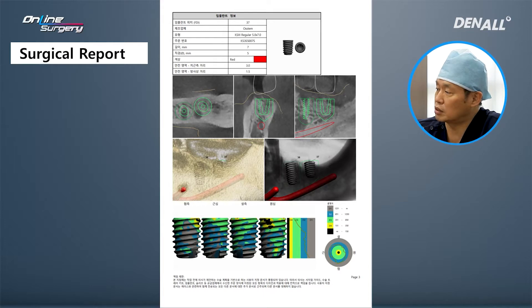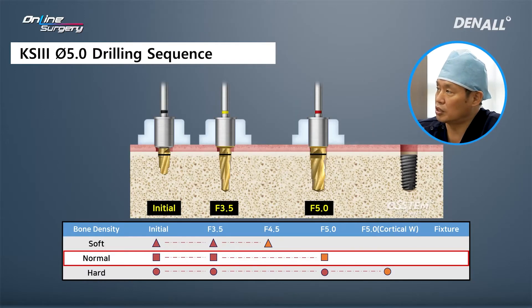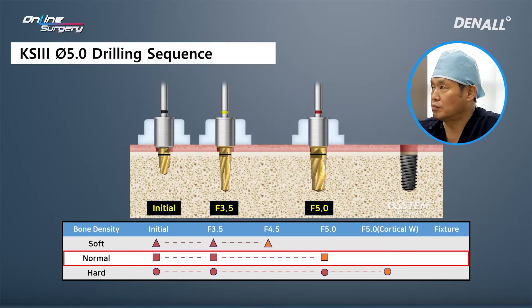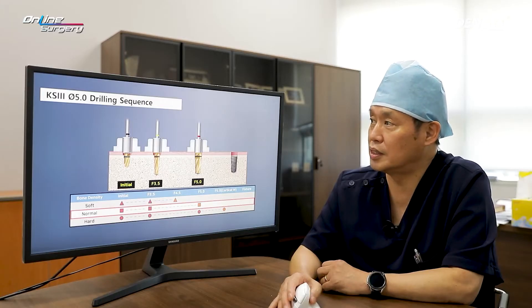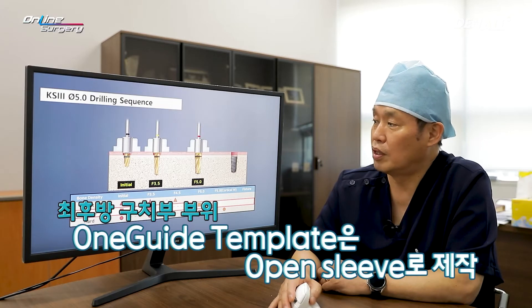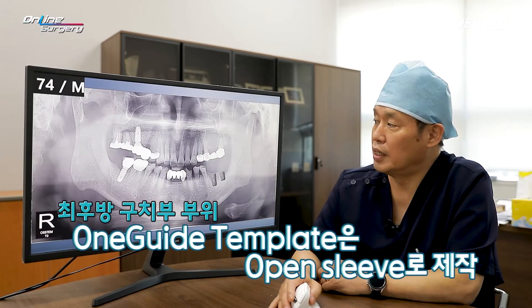This is the extraction socket — the alveolar bone state is fairly favorable. KS3 5.0 implants were planned: in number 36, 10 mm; in number 37, 7 mm. In the most distal area, we need to consider the patient's level of mouth opening, and the one guide template was made in an open sleeve type to be used for surgery.